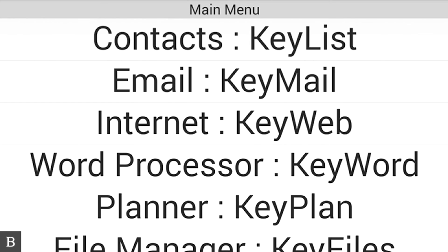We're happy to say that in the BrailleNote Touch, the Keymail client has also been rewritten from the ground up. Keymail has the capability to connect to many different types of email services. Whether you're using Gmail, Exchange, or IMAP, any type of email account you want to connect to, the BrailleNote Touch Keymail can pretty much do that.